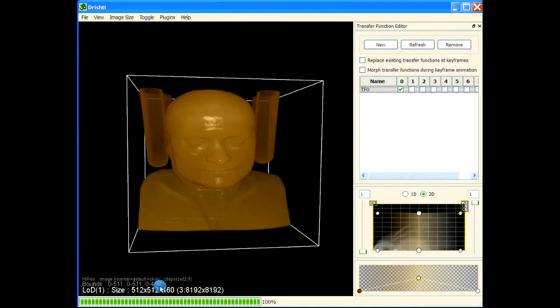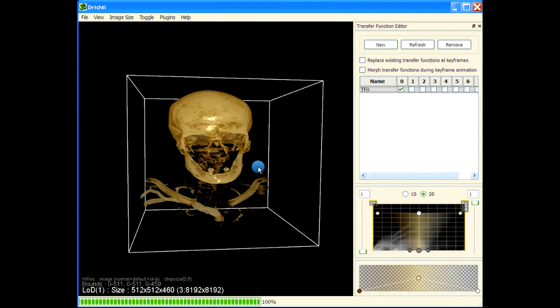And this is your dataset. Using shift key and then left mouse button to change the transfer function.